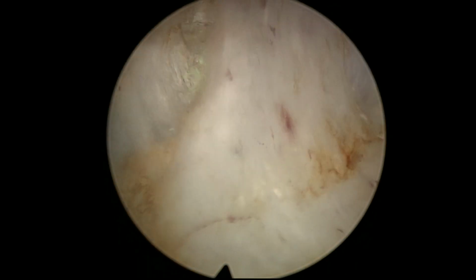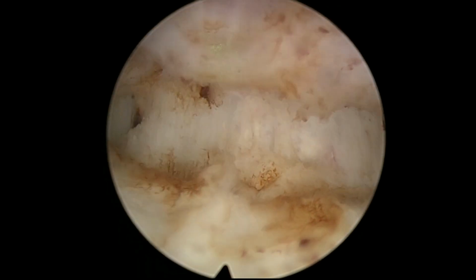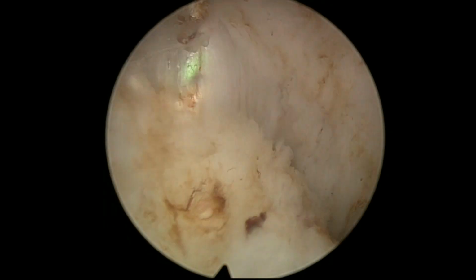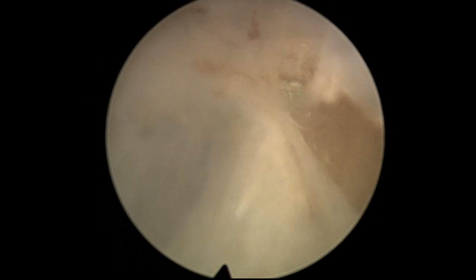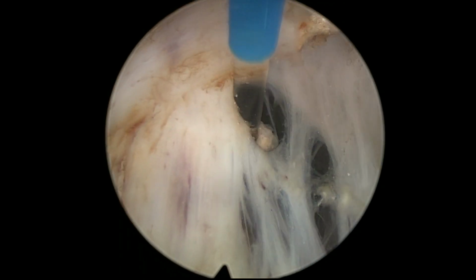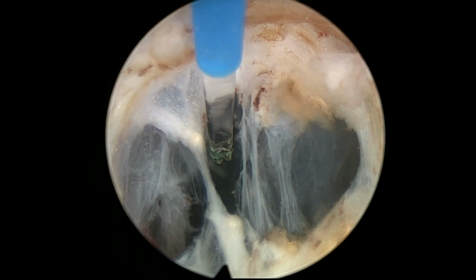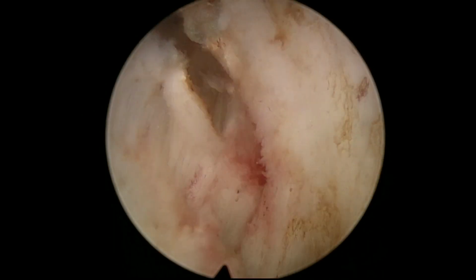As I said, we are always judging if the depth is correct. That is the sign that we look for. Circular fibers with vertical fibers below. This is the place where we enter the bladder. So that's an opening now at 12 o'clock. And we have to cut the bladder neck coming down.